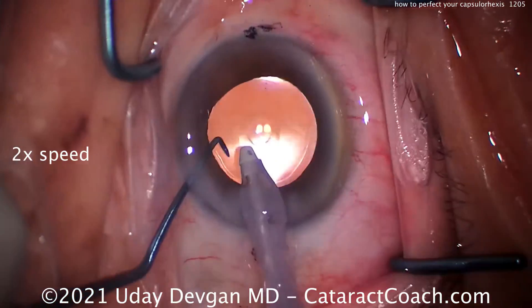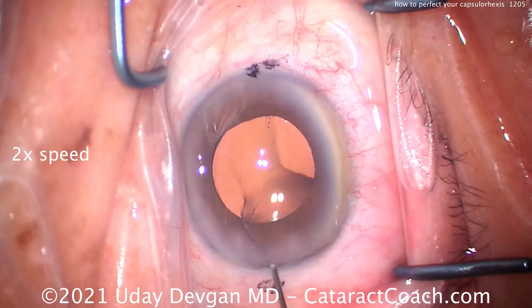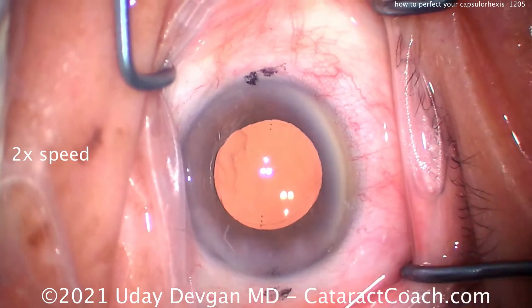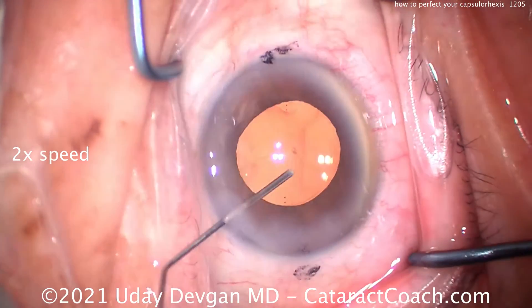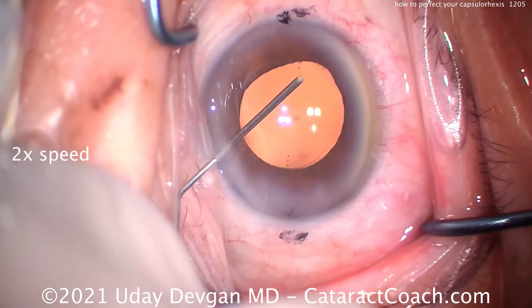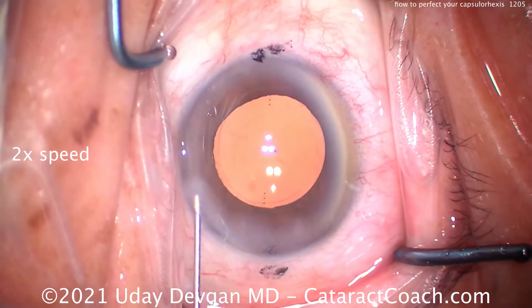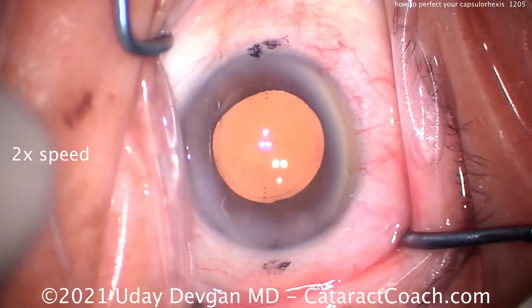They're also going to see centration on the lens. Here you can see another EDOF case. These lenses — whether it's a trifocal, bifocal, or EDOF lens — are very, very sensitive to centration, and you do want to line up those Purkinje images. Notice that the capsorexis we created is centered on the Purkinje images or the visual axis; it's not centered on the geometric center of the lens capsule, because that's not where we're going to place the lens. Look at lining up that first and fourth Purkinje images — that is just about right.